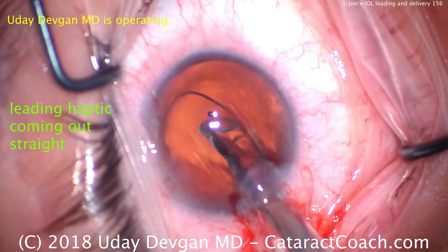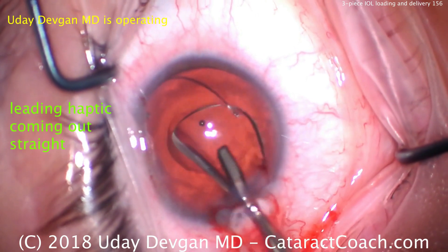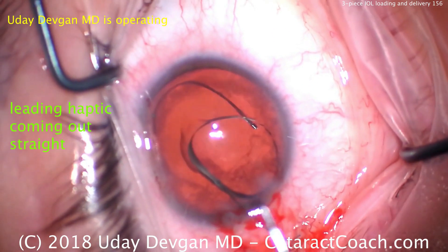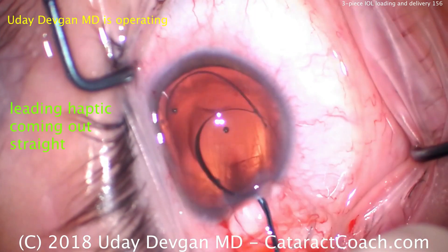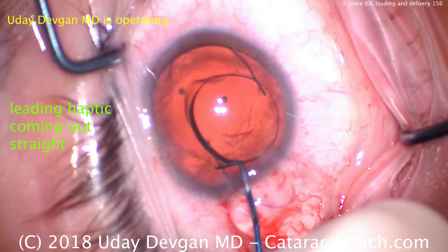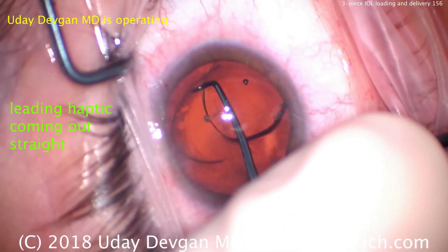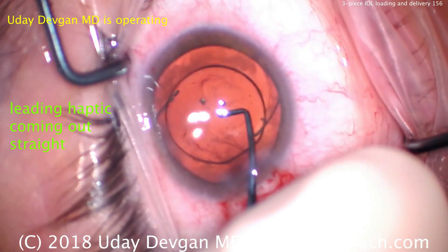Let me show you how to figure out how it should go. Look at the leading haptic — it's coming out correctly. Remember that leading haptic looks like the number seven, and the trailing haptic looks like the capital letter L. That's correct. The lens came out as expected from the injector. This is an old case from cataract coach video number 156 from a couple of years ago. Now we can dial in that second haptic, and it's in the bag.